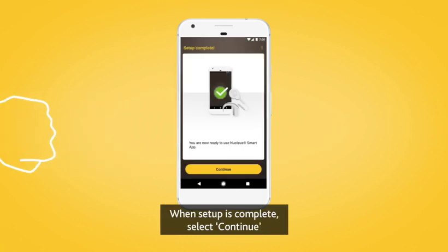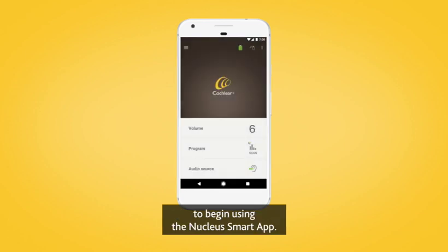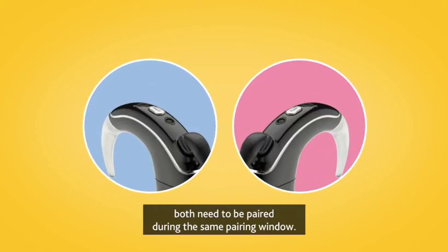When setup is complete, select Continue to begin using the Nucleus Smart App. If you have two sound processors, both need to be paired during the same pairing window.